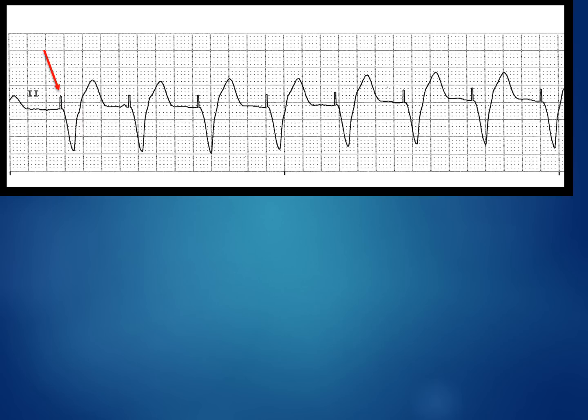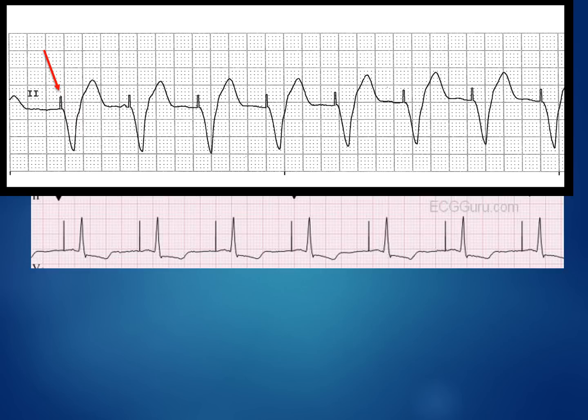Now let's look at another strip. What's going on with this patient? Pause the presentation again and consider your answer. So again, I see a very skinny vertical line that does not look like part of my normal EKG rhythm. Now, what is following that pacer spike? I see a tiny P wave followed by a QRST. So there's only one spike, then a P, QRST. So this patient, because that P is associated with the atria, is atrially paced.